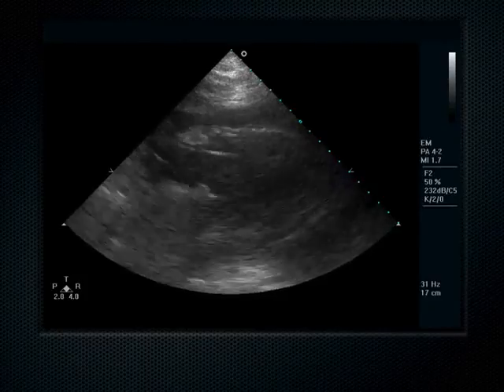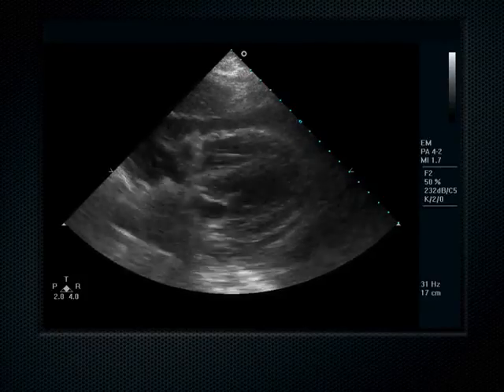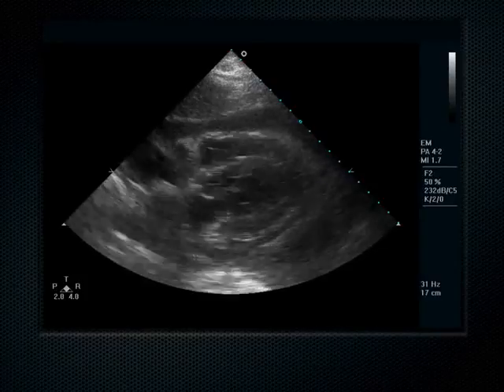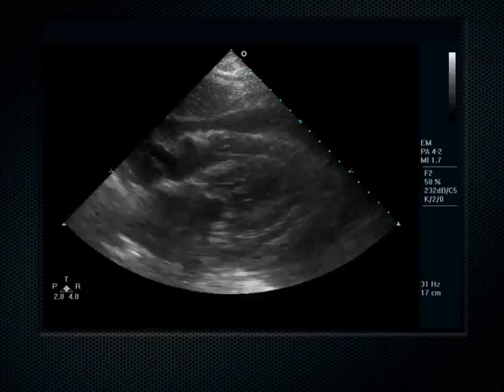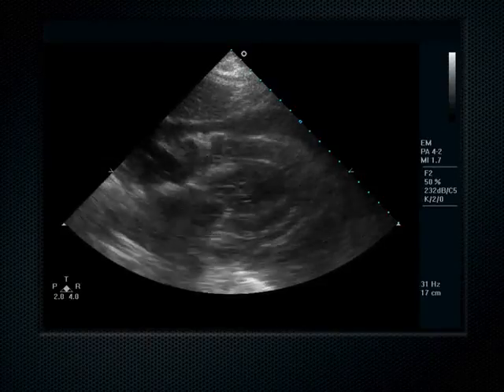Turns out emergency physicians have a pretty low success rate of floating transvenous pacemakers blinded. You watch cardiologists do it, they do it like they could do it in their sleep. They do it like they're blinded. But they're so good at it. But emergency physicians, we struggle with this.